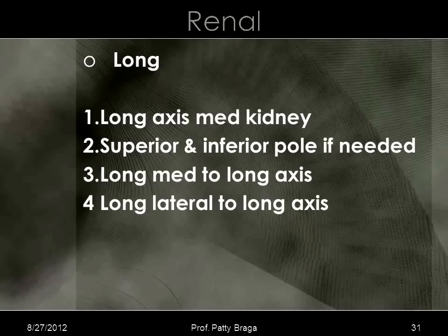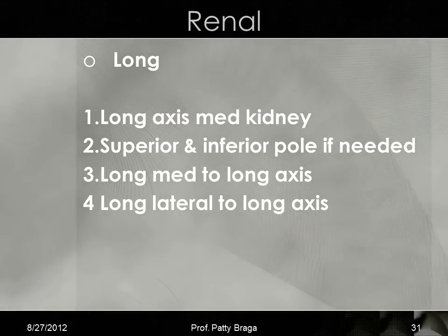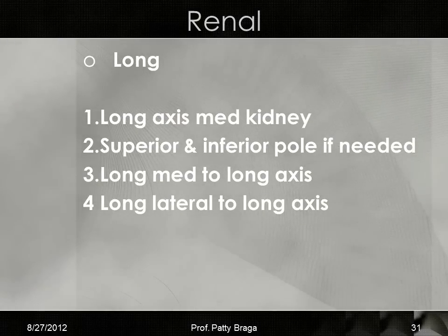If you have the patient take in a deep breath, it pushes the diaphragm down and in turn pushes the organs in the abdomen further down so that you don't have to fight with the ribs. Your kidneys and other organs in the abdomen will now be below the level of the ribs and make it much easier access for you to scan.